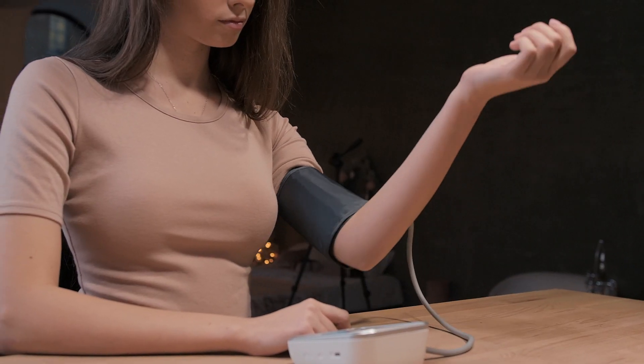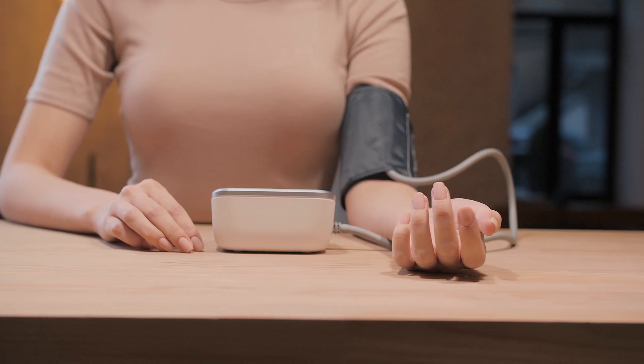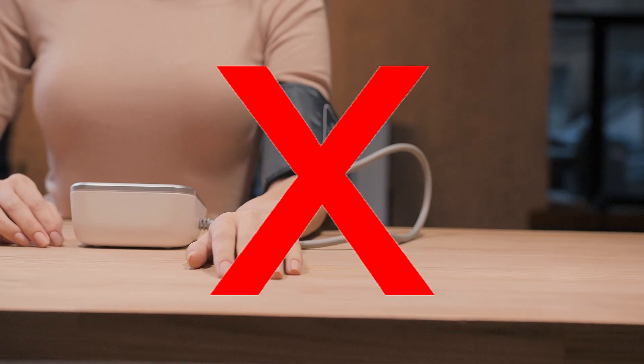1. Do not raise your hand or hold it in the air. 2. Do not turn your hand. Your palm should not be facing down on the table.